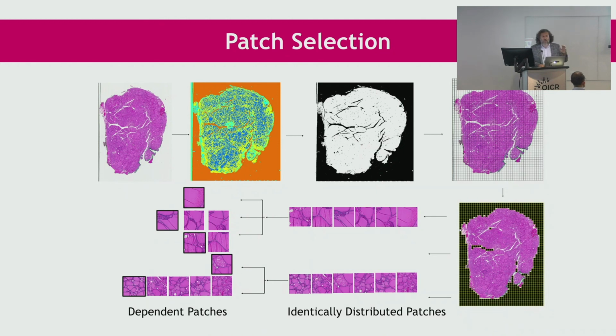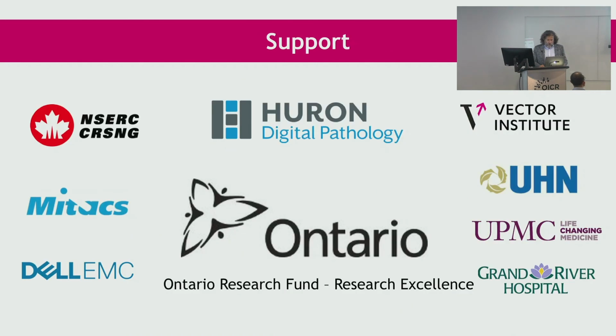Whatever is in lung and breast and prostate most likely is benign if you have a large database. If you're talking about 500,000 scans from all body parts, and you see a pattern in all of them, well, if it is everywhere, most likely is benign. Maybe it's fatty tissue. And everything that is special and is not very frequent, most likely is not benign. We are, again, talking from the perspective of the computer.